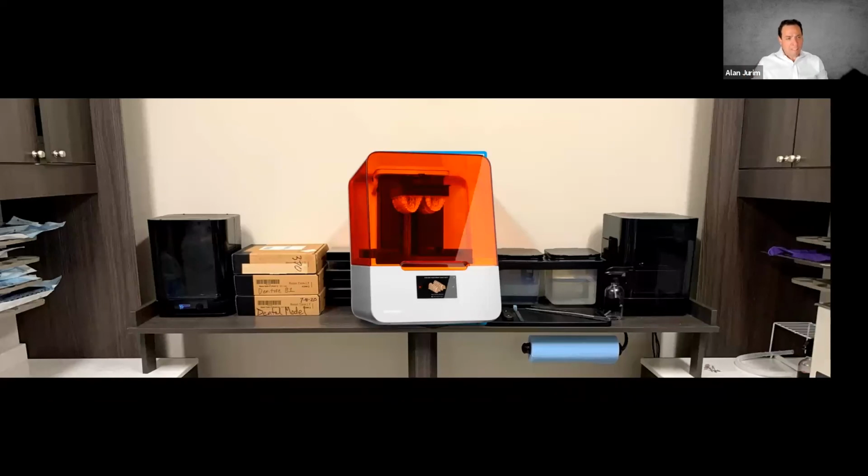What I found is that everything to the right of the printer here is what I call our dirty environment. That's where we're going to have more resin, other areas, and rubbing alcohol, and we're going to be wearing gloves. Once we've post-processed or post-cleaned it, it moves from this area over to the curing box. The curing box has 2 settings: how long it's going to cure with the light, how long it's going to expose it, and also what temperature it should raise to inside there.